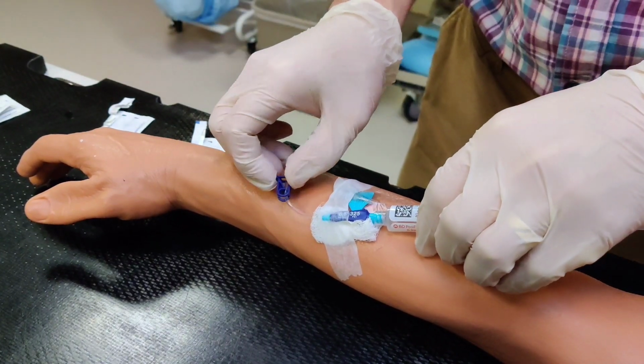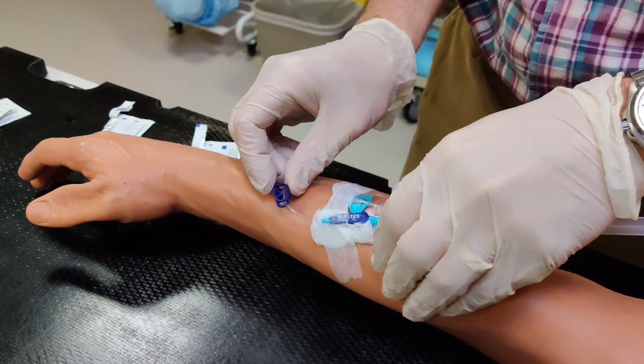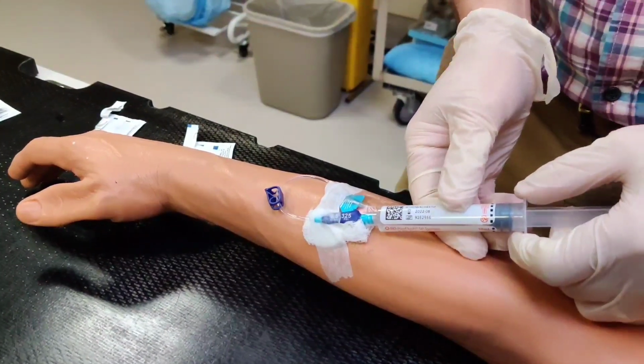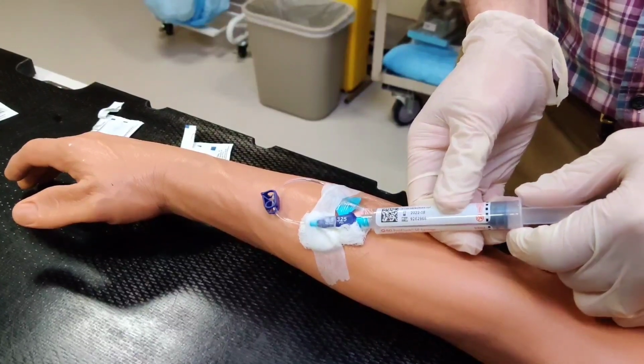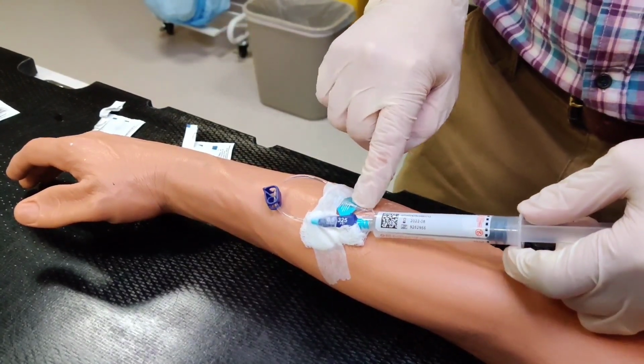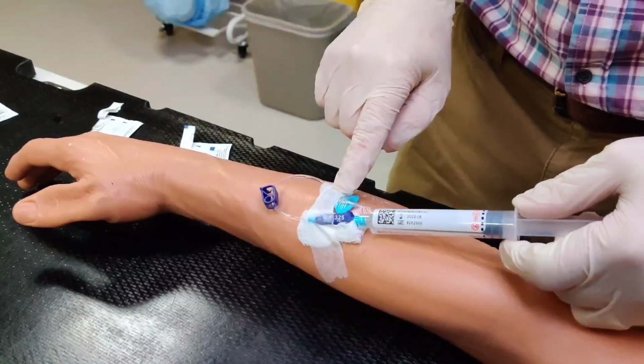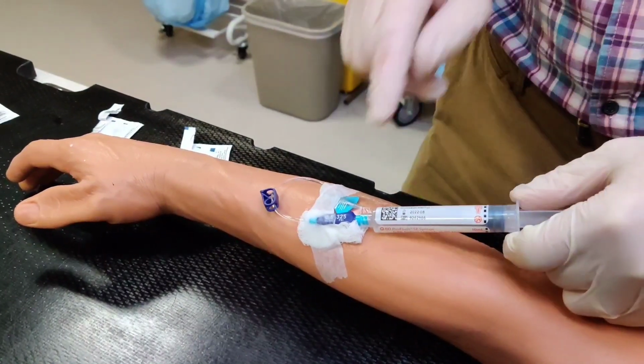I'm going to open the clamp so I now have access to the IV. That's just a gentle flick there. The first thing I'm going to do to test the patency of the IV is draw back just a little bit, and what I'm looking for is a little bit of a flash of blood right at the IV line in this area here. So I draw back a bit, look for that blood.